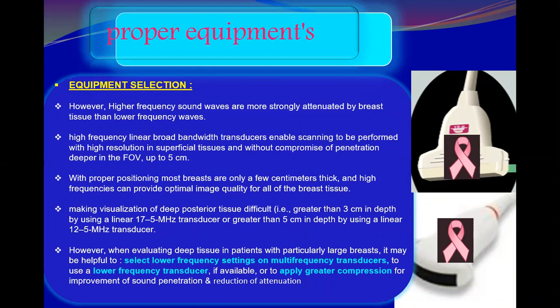As we described, for modern breast ultrasound, the linear broad bandwidth transducer enables us to scan with high resolution in superficial tissue without compromising penetration deeper, with a field of view up to 5 centimeters depth.